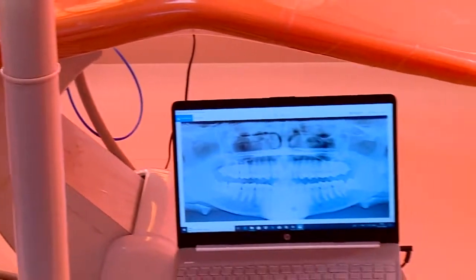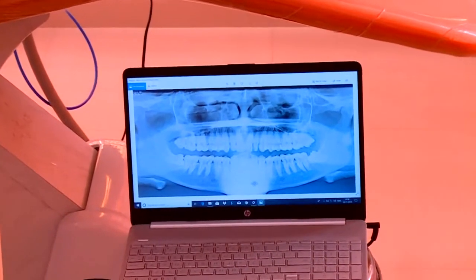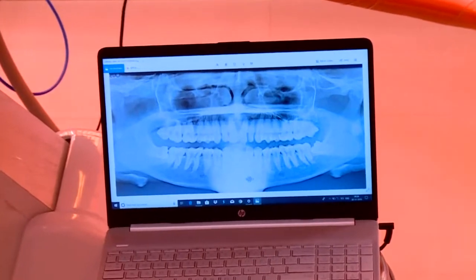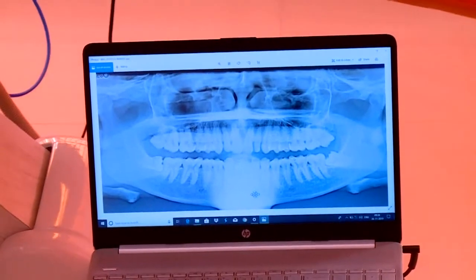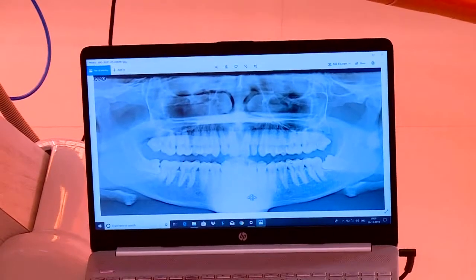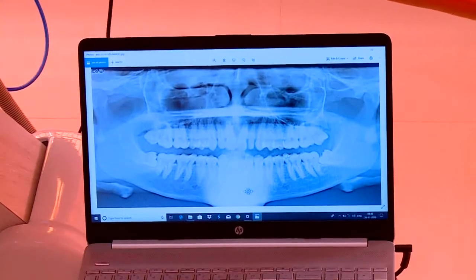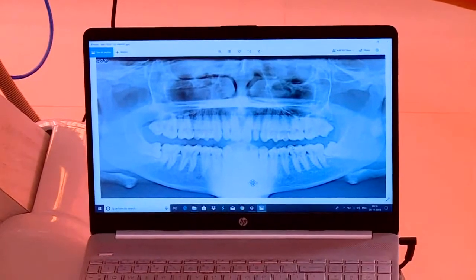Okay, so this is a horizontally impacted mandibular third molar. Okay, you have lots of classifications. In the Pell and Gregory classification, the highest point is at the occlusal level, and half the tooth is inside the ramus. So you can call it a position A, class 2.